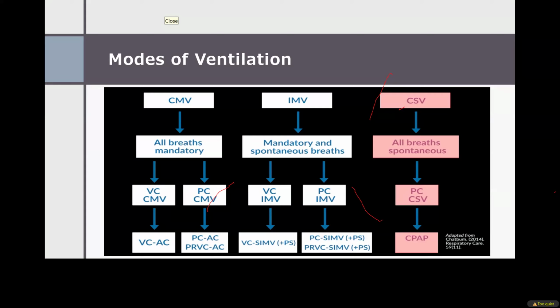And I don't know, again, whether you use closed suctioning or open suctioning. We have closed suctioning, so the catheter is never exposed to the outside air or bacteria. It's all closed in the system.